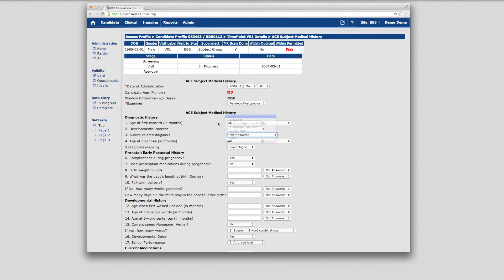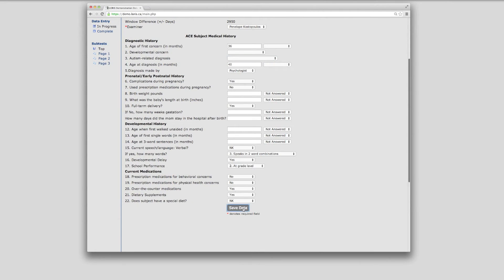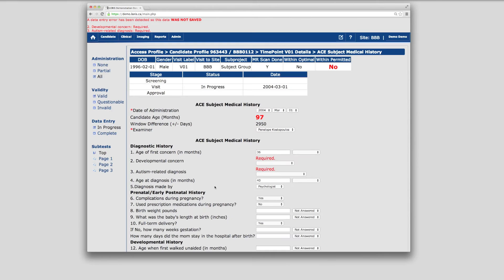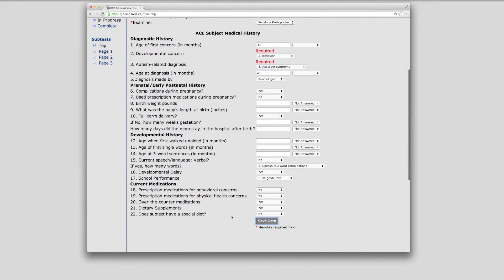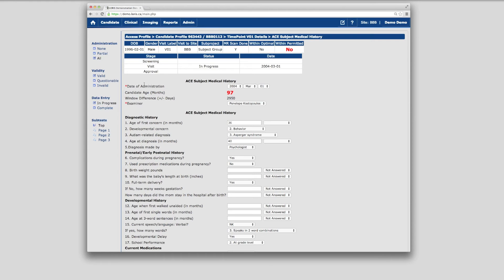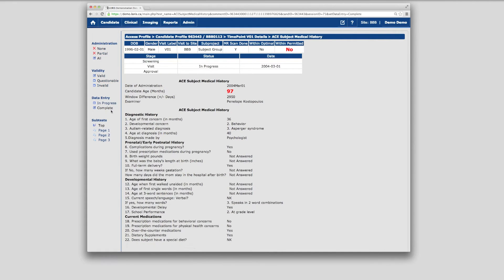If there are any data entry errors — meaning data was missed or entered inappropriately — the form will not save. Instead, an error message will be printed at the top, and error messages will be highlighted beside the field that requires correction. Once data entry is done, administration and validity flags can be set in the left sidebar, and the form can be marked as complete.